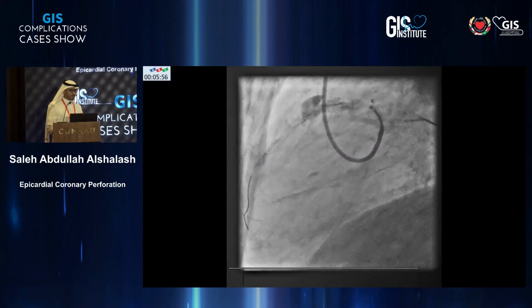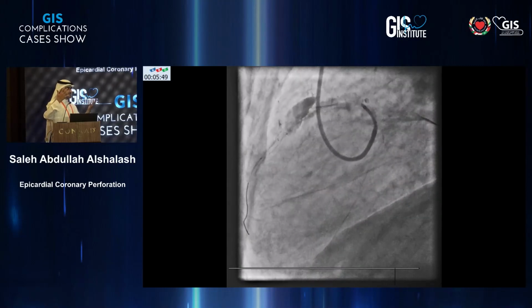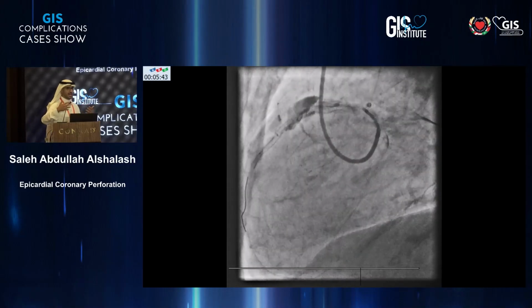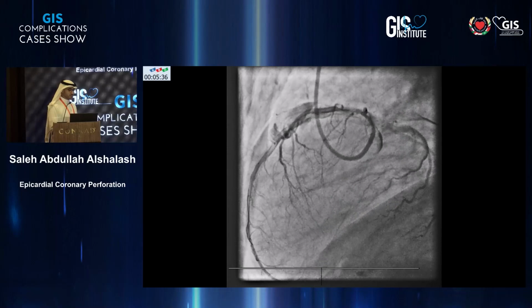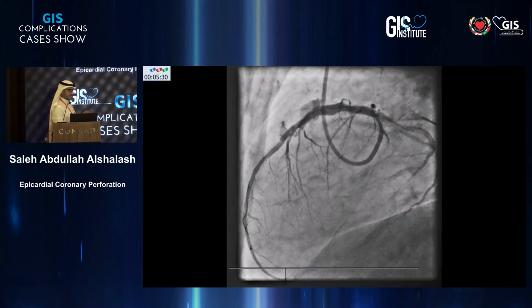We took a small puff and it was occluded, and I really could not understand, where are we perforating? Like, which chamber is this? So my colleague, who was very senior, suggested a lateral. I resisted this. I said, a lateral? I don't even know what I'm looking at in a lateral view. But I said, no, let's just do a lateral view. And it was really beautiful. So this is at an angulation of maybe 85.